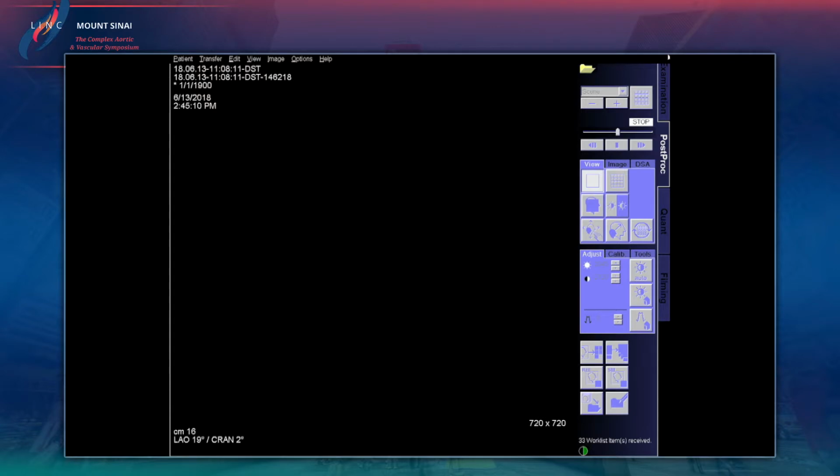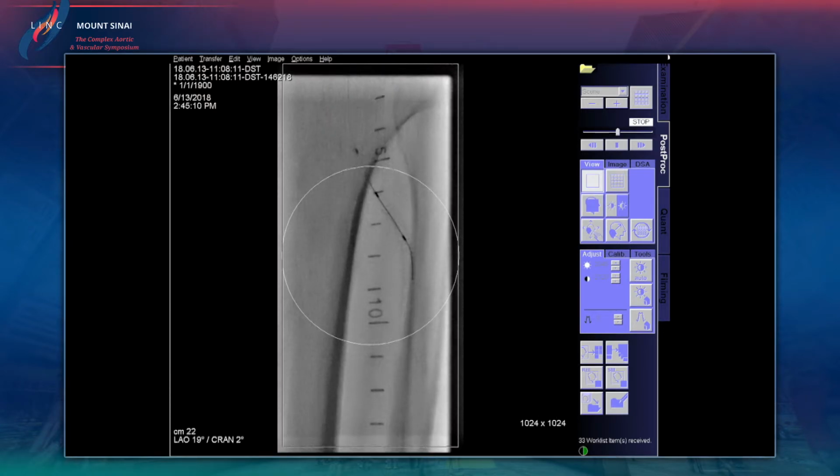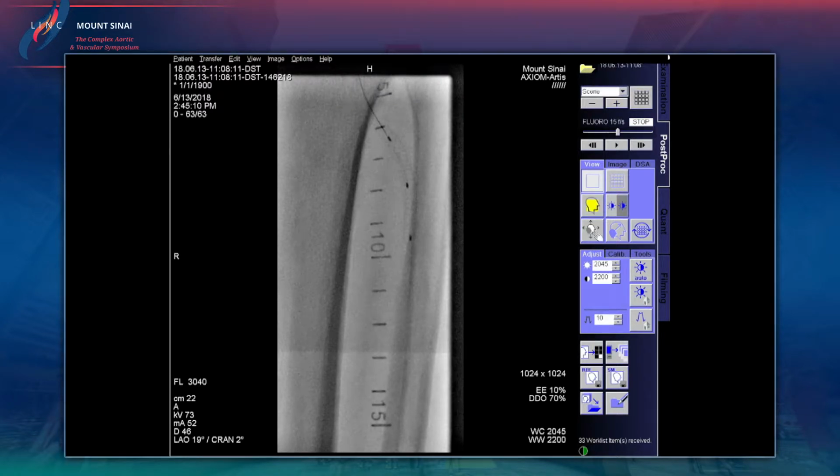So I'm just going to take this down and take a selective picture from within the stent. There you go. Let's take a selective shot here and get an idea. Because I think the idea is how can we give a durable therapy? He's had DES, he's restenosing and also reblocking in the proximal aspect of this, and then he's having skin breakdown. So low mag, guys.